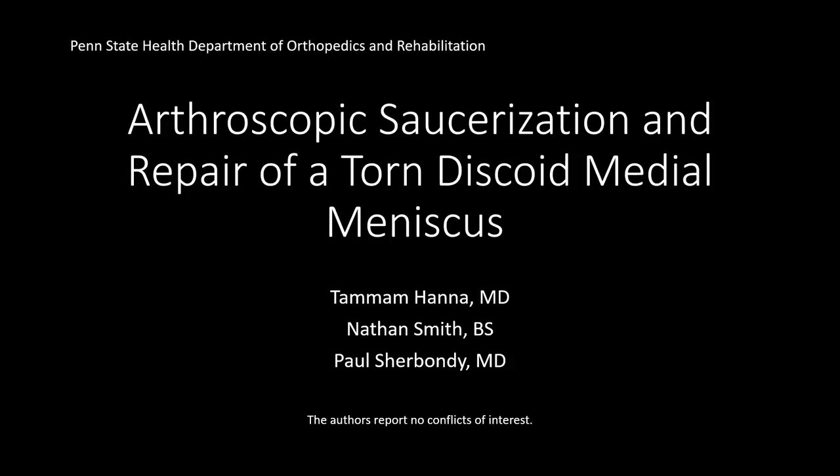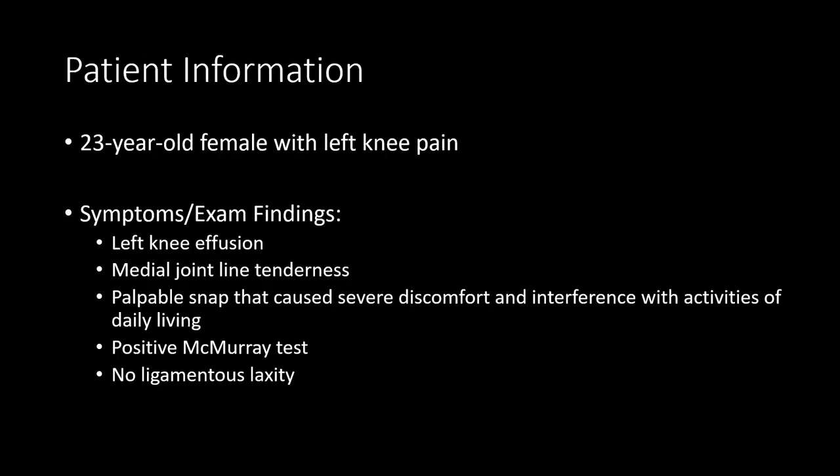This video describes the technique of arthroscopic saucerization and repair of a torn discoid medial meniscus. A 23-year-old woman presented to our orthopedic clinic with knee pain mostly on the medial side. She also described a snap that was followed by tenderness of the knee and swelling. The patient reported a notable decline in her quality of life due to her symptoms.